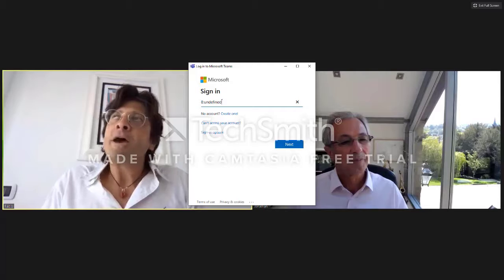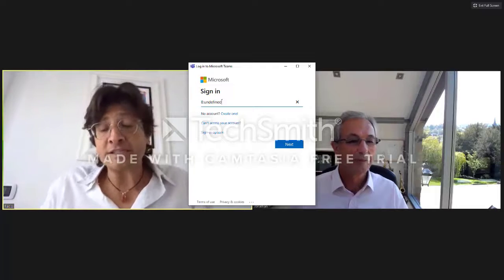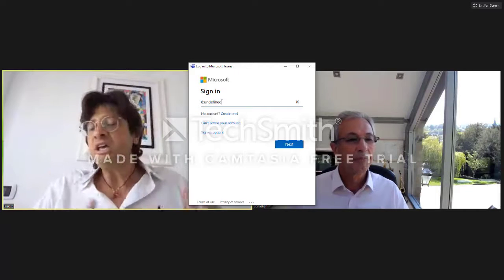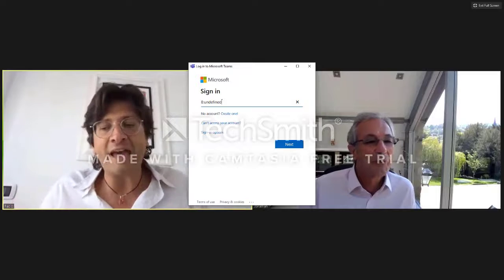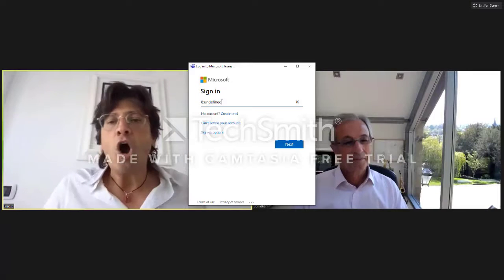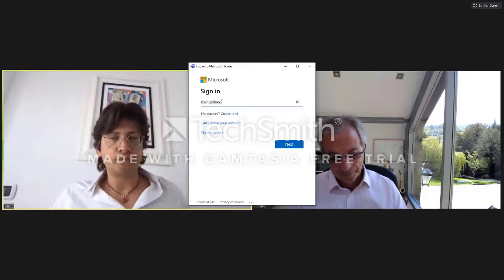It's a new piece of beta titanium wire, and it takes no more than 10 minutes to model. To be honest, I'm testing this kind of approach that I like a lot, because patients love it, it's not expensive, and it's very light. Usually, if I have six appointments, only a couple of times, only two times, I have to change the wire, no more.